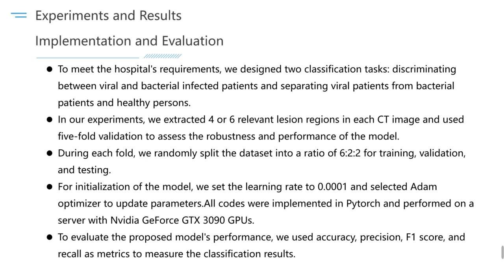During each fold, we randomly split the dataset into a ratio of 6:2:2 for training, validation, and testing. To evaluate the proposed model's performance, we used accuracy, precision, F1 score, and recall as the metrics to measure the classification results.